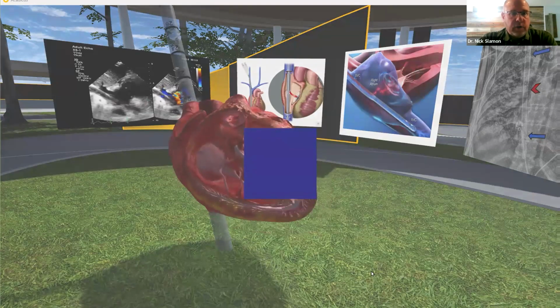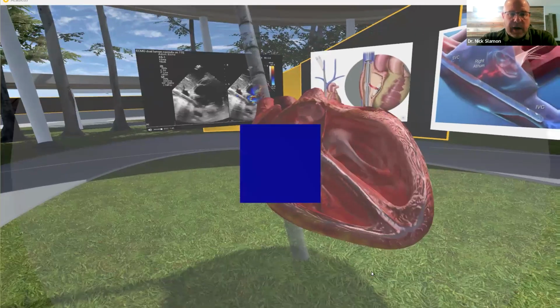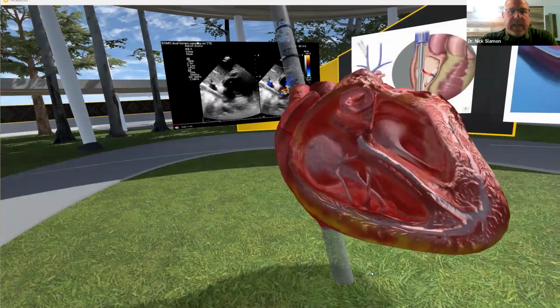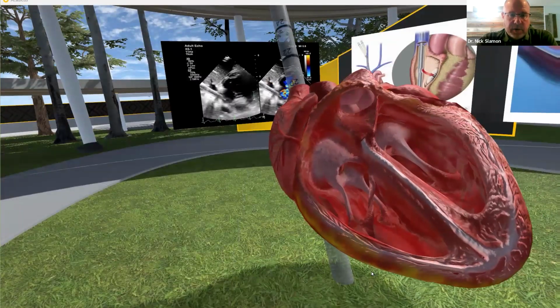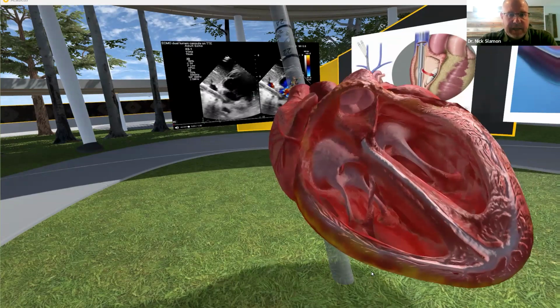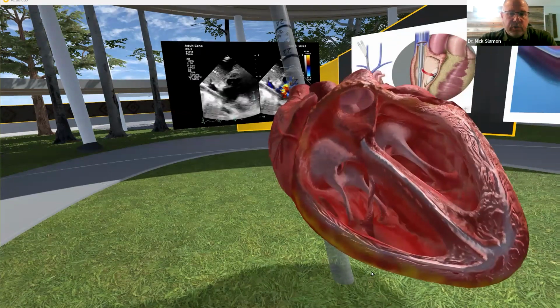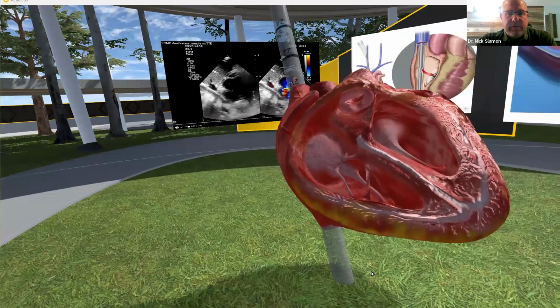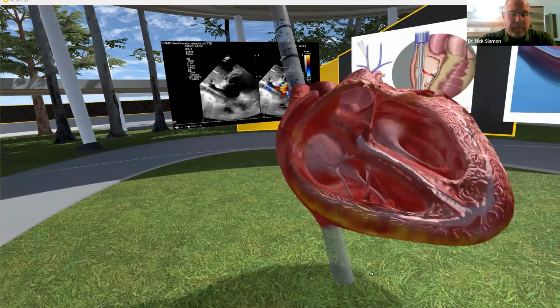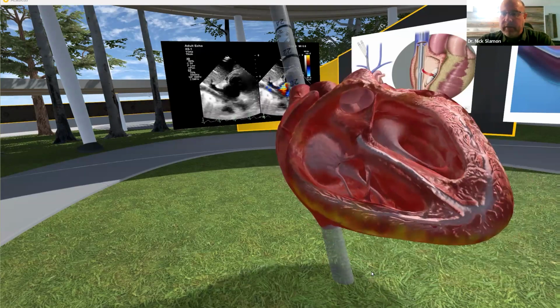So you can take short loops of video like an echocardiogram and really drive the message home for the learners that this is where the cannula should be, and this is where the jet of that infusion of red blood that's coming back from the ECMO circuit should be directed across the tricuspid valve. So just really good use of new technology that's come out in Acadicus in, I would say, probably the past year or so, the media displayer and the video displayer.